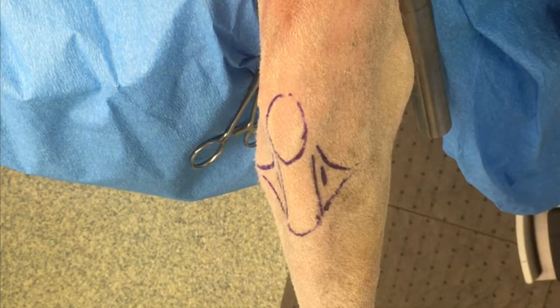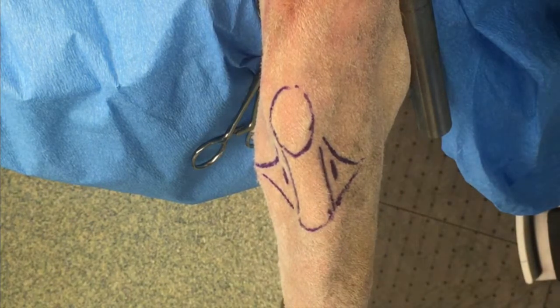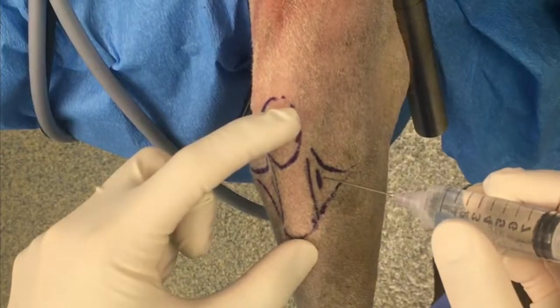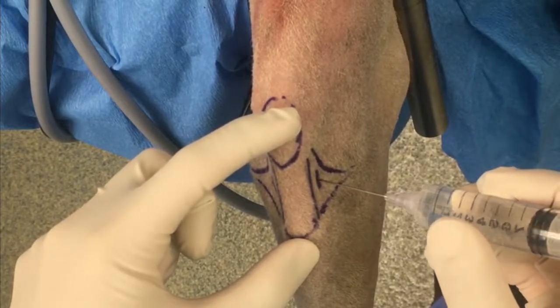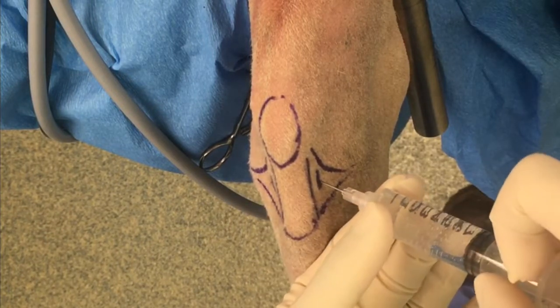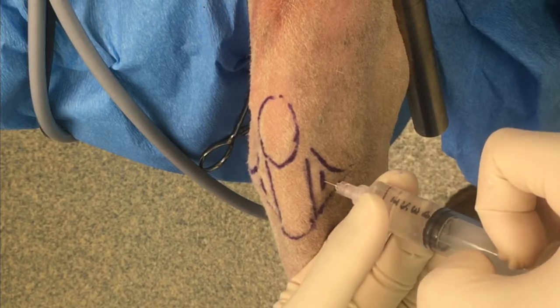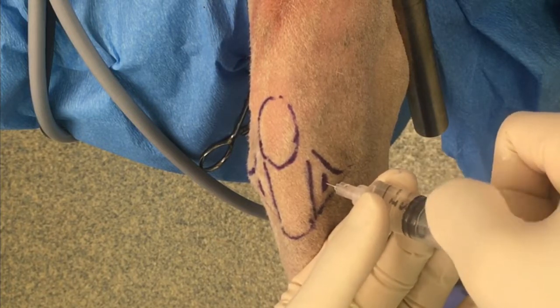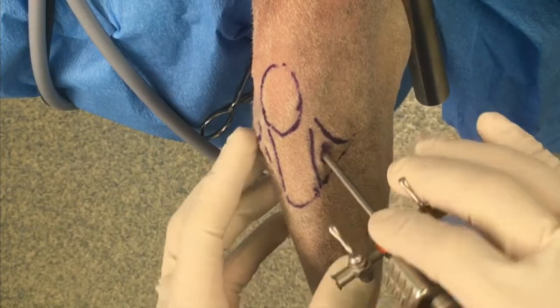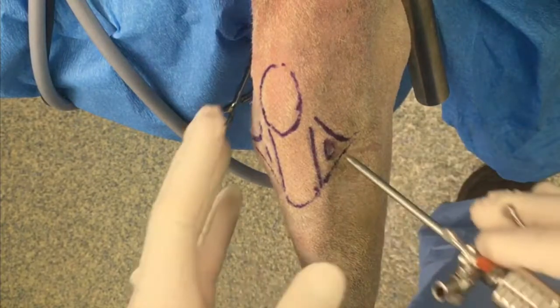The ports are created at the middle of the joint, slightly abaxial to the patella tendon on either side. First, the stifle is distended with saline. In a medium-sized dog, approximately 10 cc's can be accommodated within the stifle. A stab incision is made into the joint, and the cannula and obturator are placed into the medial compartment.